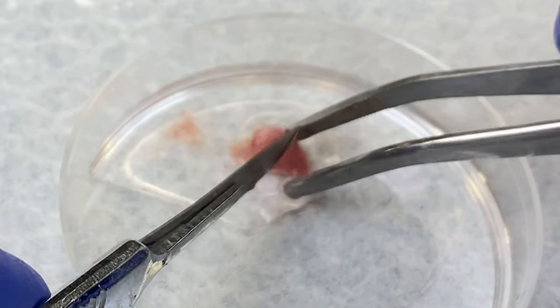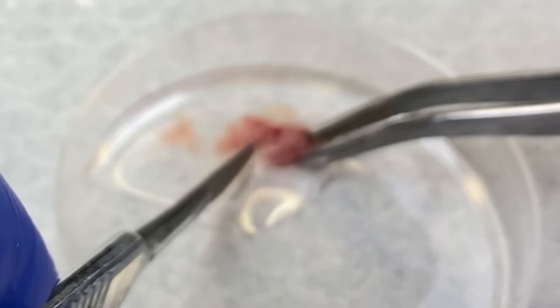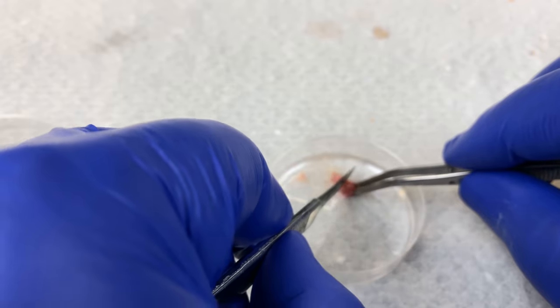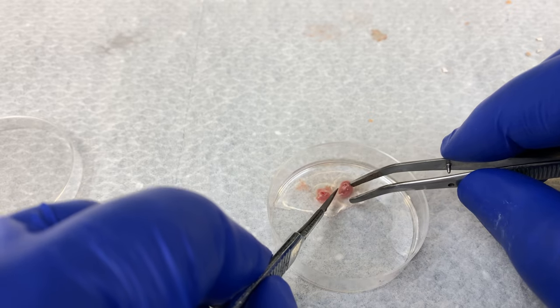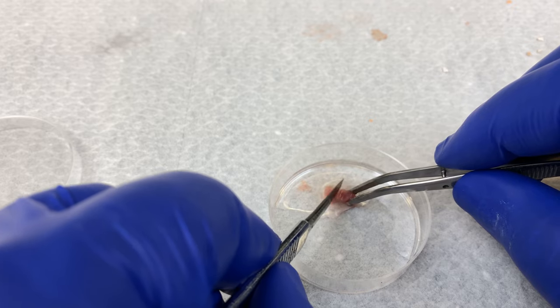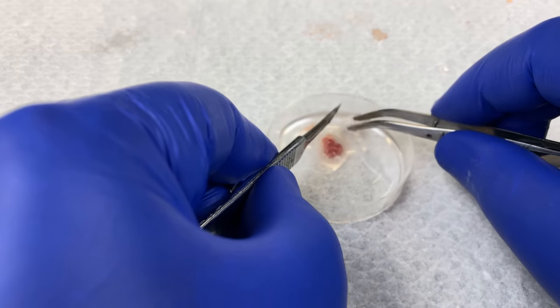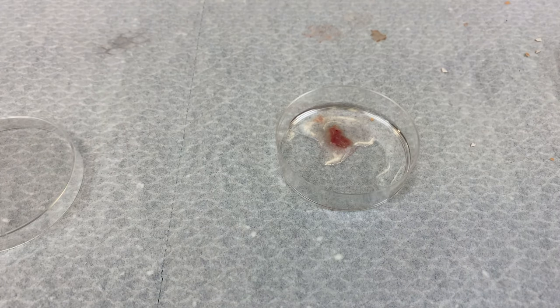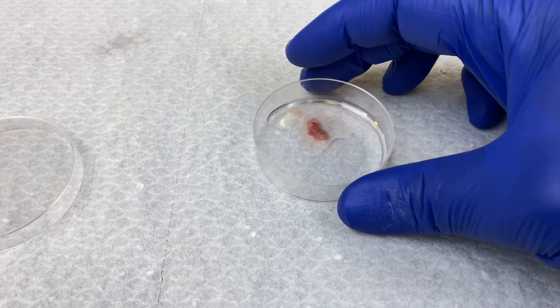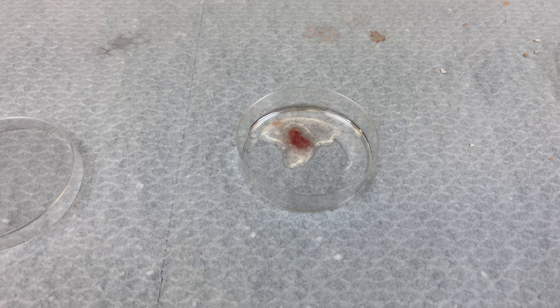Once again, these are sterile, and I will cut this heart up into very, very small pieces. The purpose of disaggregation is to break this solid organ up into individual cells. With the technique we use in the lab, we must have them as single cells growing on the flask. This is for diffusion of waste, as well as nutrients and oxygen and carbon dioxide into the media.